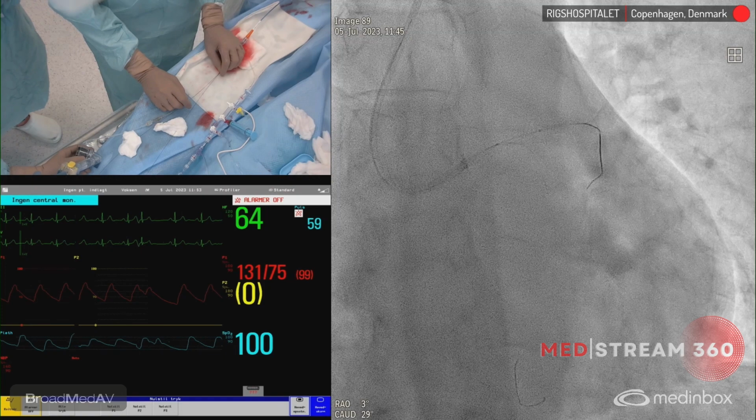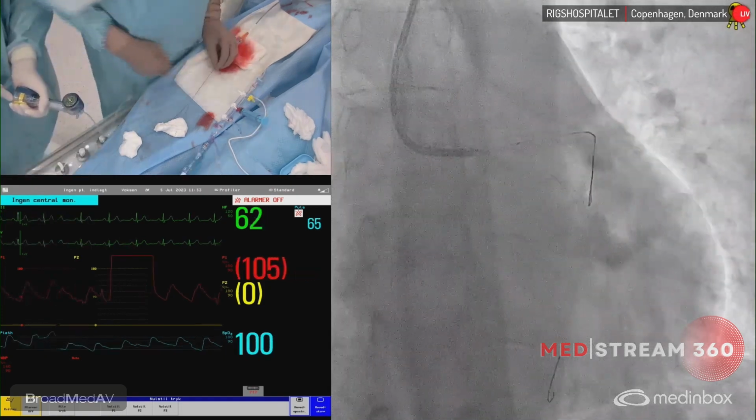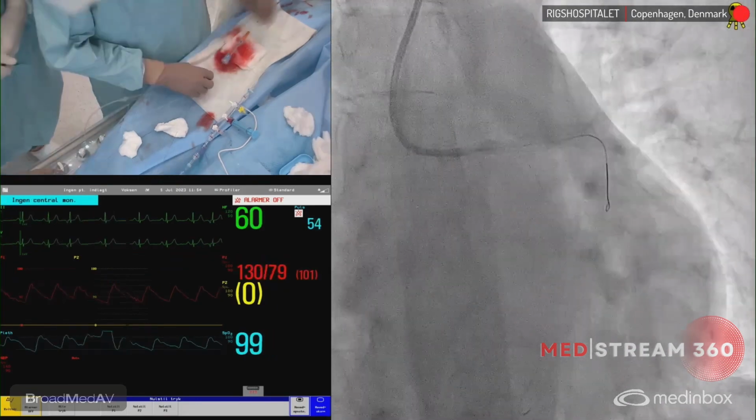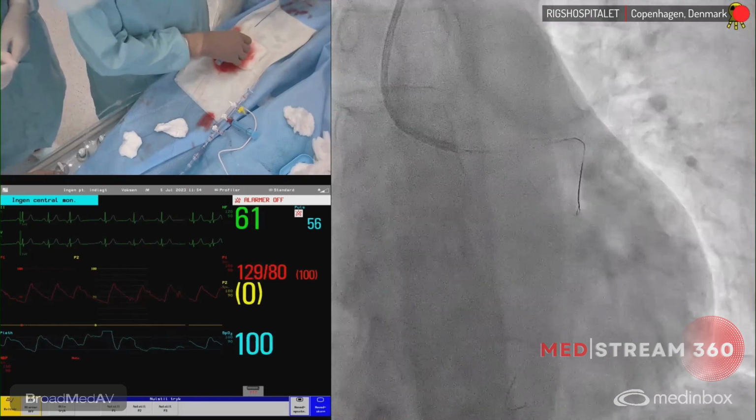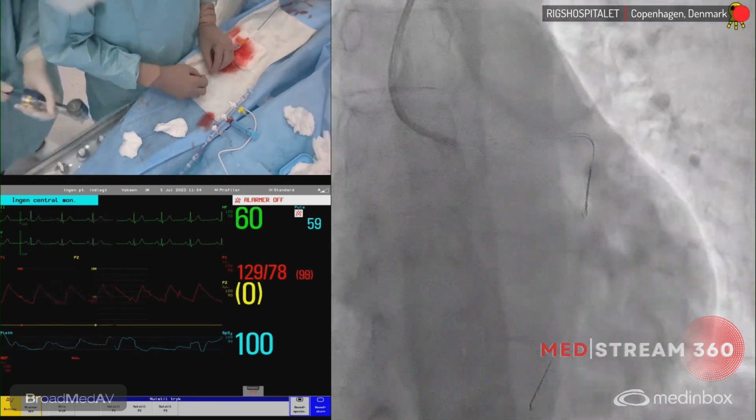Not to the distal part, but start out with a POT, yeah. And we need a distal carina here. It's almost vessels of the same size based on IVUS. Now it's a 15, and there was only a left main of, or was it 8 or 10? You said. But do we need to flare it a little bit?